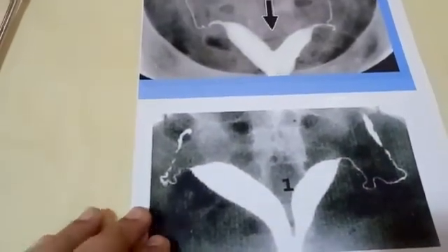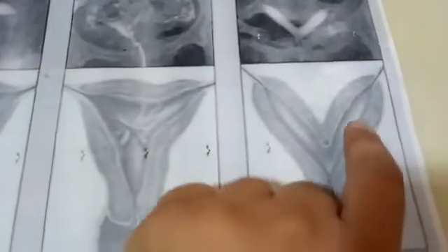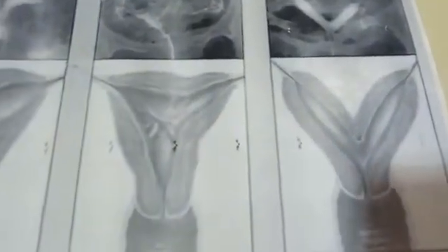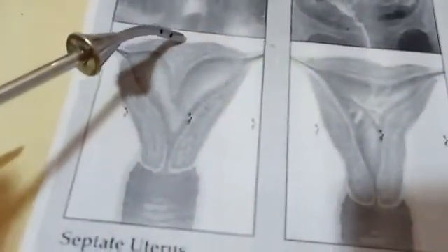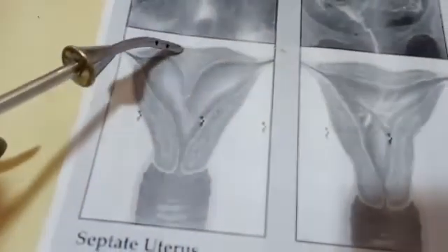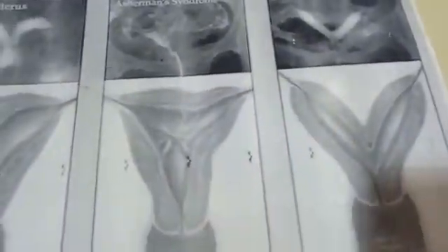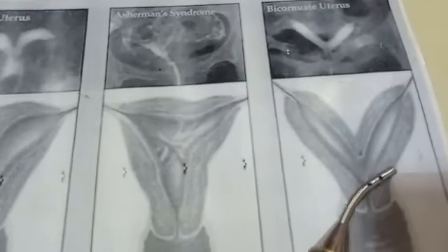Here is a picture of bicornuate uterus — there are two separate cavities. In septate uterus, the cavity is divided into two parts. To differentiate by laparoscopy, look from above: in bicornuate uterus the external outline is abnormal with two parts, while in septate uterus the external outline is normal.